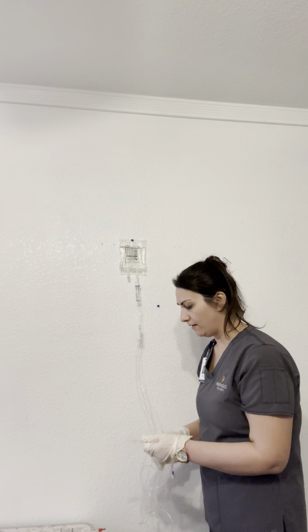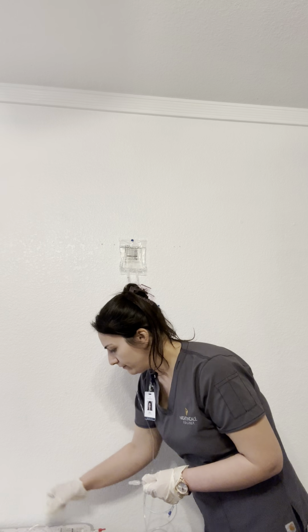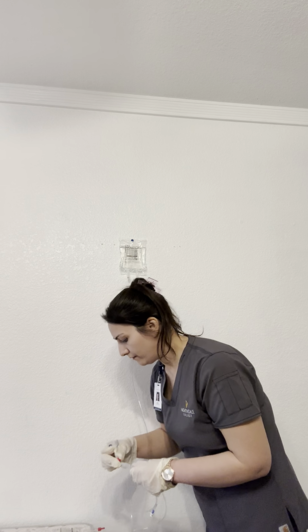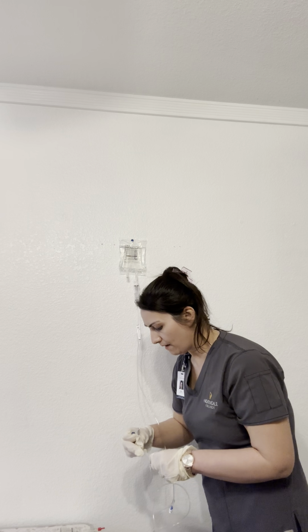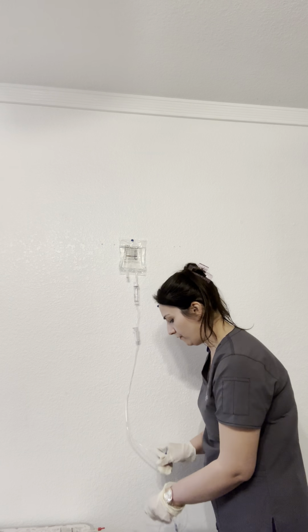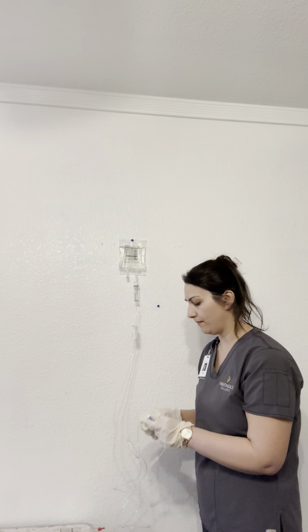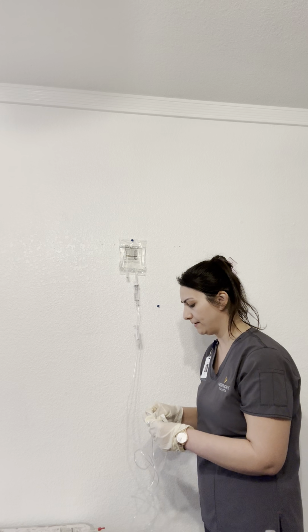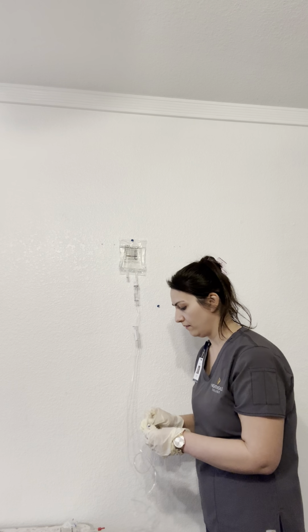And we're going to make sure that we put a cap on here. Put the cap on. And we're just going to alcohol that Y port.